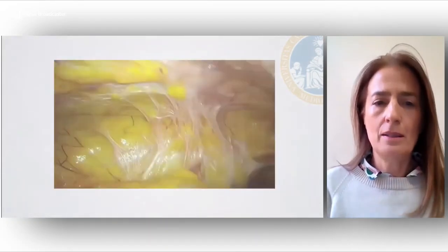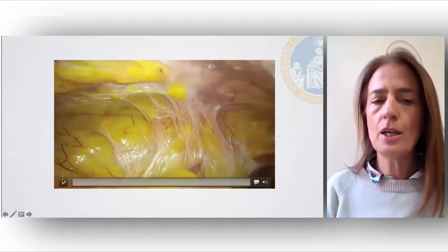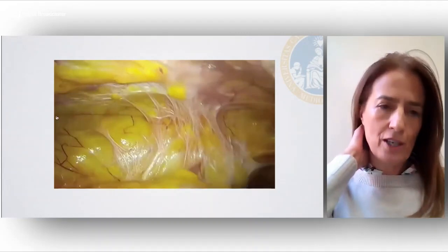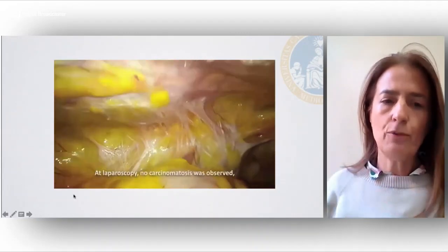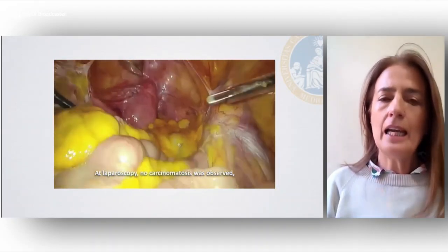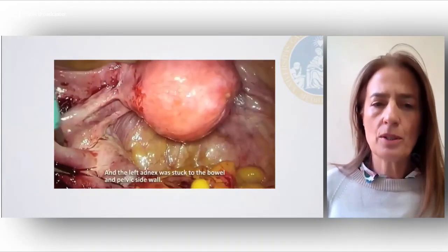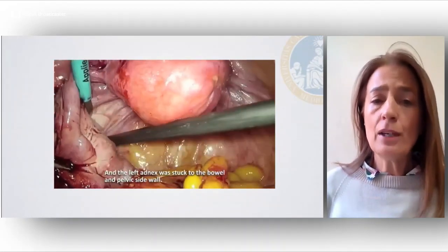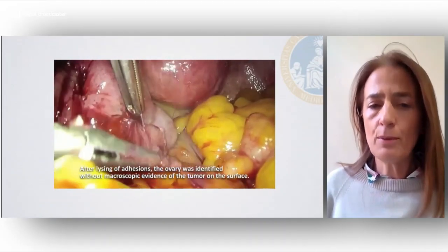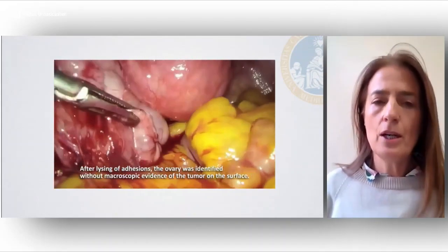It happened to us, this case, with 3 borderline tumors. So monolateral oophorectomy, you can play it, Francesca. Monolateral oophorectomy and contralateral cystectomy. A recurrent lesion of 10 millimeters, something like that, was detected. During laparoscopy, it was almost impossible to understand exactly what it was.